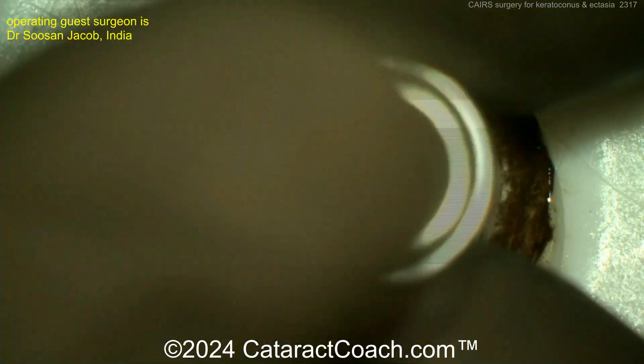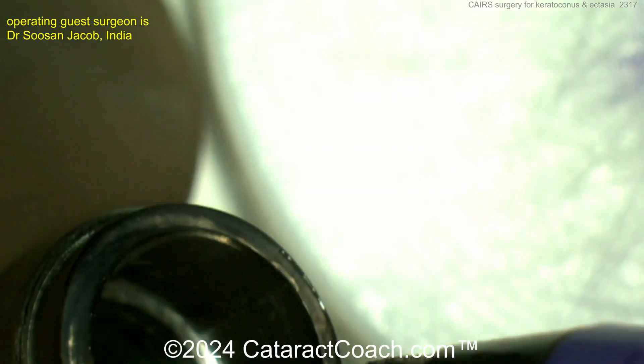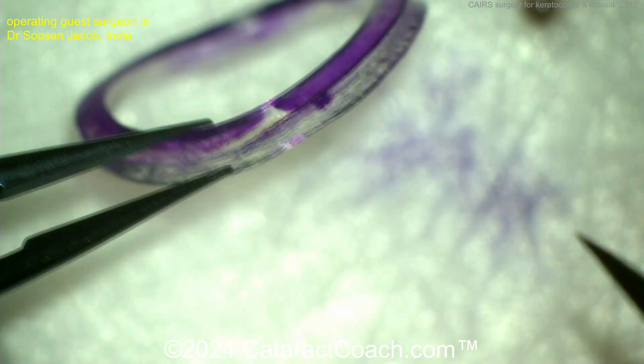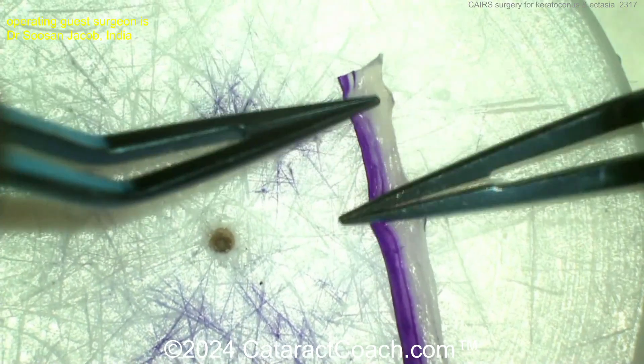Here's the trephine, 65 to 80. With this, you're going to make a ring, and that ring can be customized. There's the double-edged trephine. And there's the ring that's been taken out — you can see it's stained purple. Now this can be cut and shaped to the appropriate size for the patient.